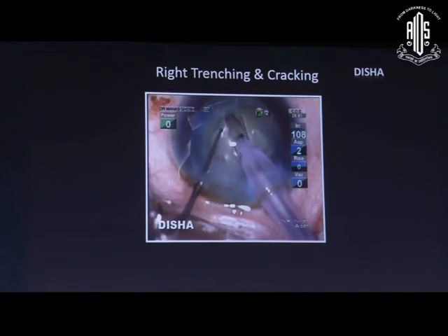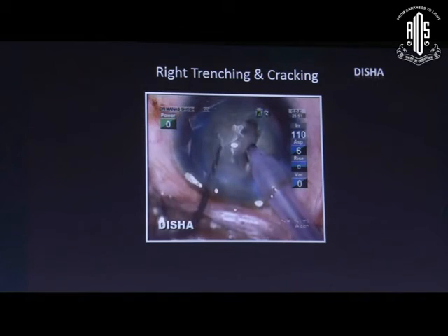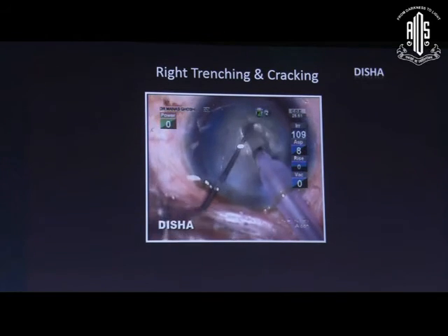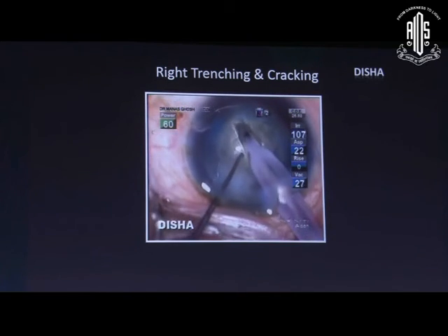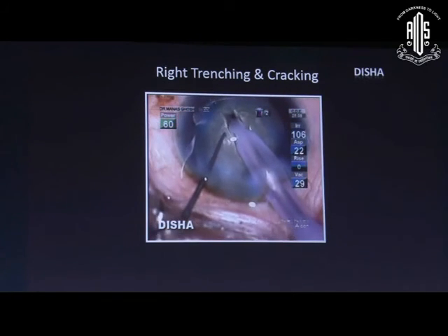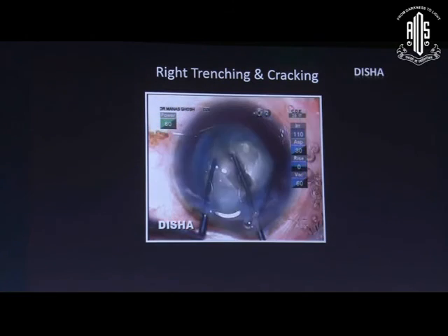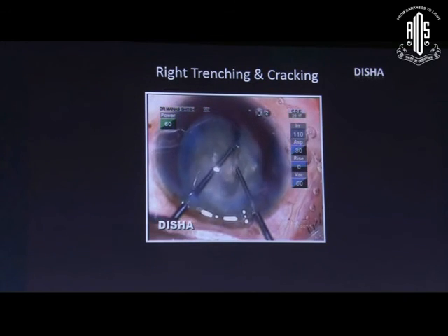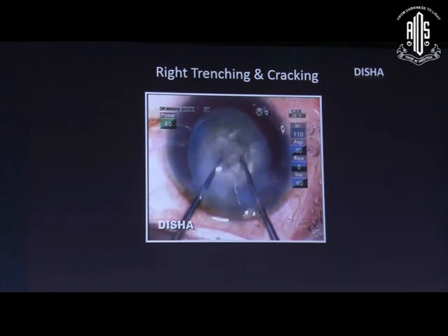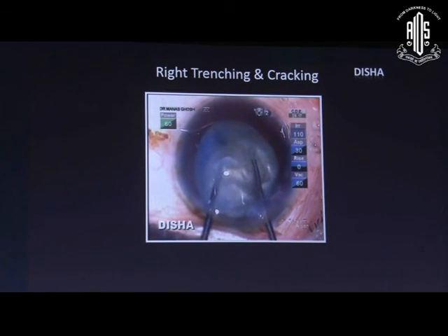While doing deep trenching we need to emulsify the fine emulsified nucleus, and every time we need to refocus very carefully — otherwise we may create a hole. Place the two instruments at the deeper part and initiate cracking from the periphery. If it is incomplete, rotate 180 degrees and complete from the other side.